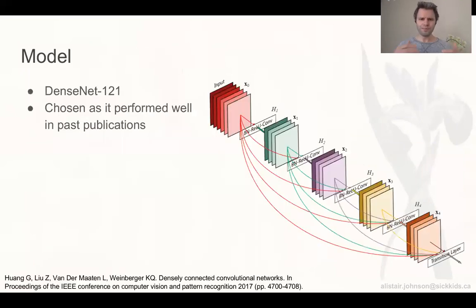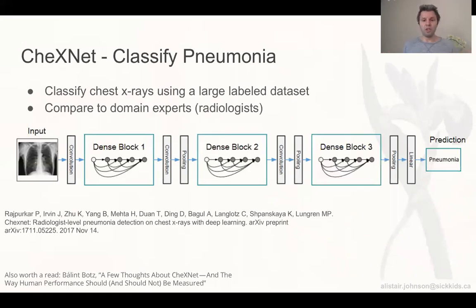Now we need some models. I won't get into the details of computer vision. There's a lot in this conference which does a better job at explaining recent advances than I could ever do. But we're going to really use a dense net here. This was just something, when people were trying out a few different models, dense nets seem to work fairly well. So most chest X-ray models are sort of based on a dense net architecture. But I don't think it's particularly important to consider only this architecture, and I'm sure the lessons hold for other architectures as well.